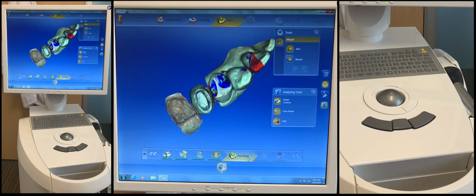There is, for some of us, and many of us, and almost all of us, a difference between what's clinically acceptable and what is textbook perfect. So we're looking for clinically acceptable to create a good long-term outcome. Many of you, who are amazing dentists and incredibly skilled clinicians, can do the textbook perfect model prep. But for most of us, like me, that beautiful textbook perfect model prep only comes periodically.